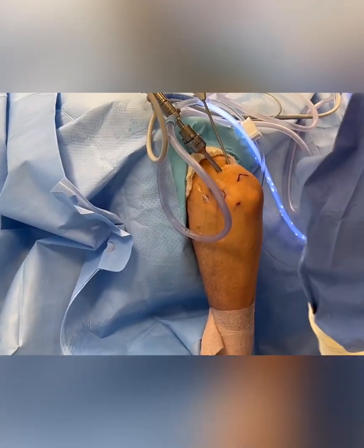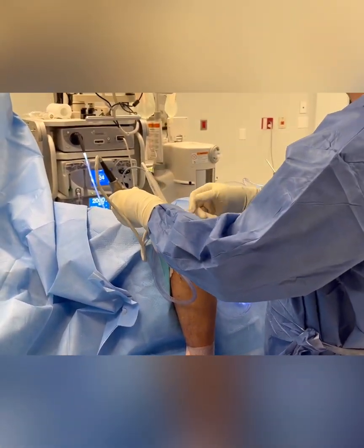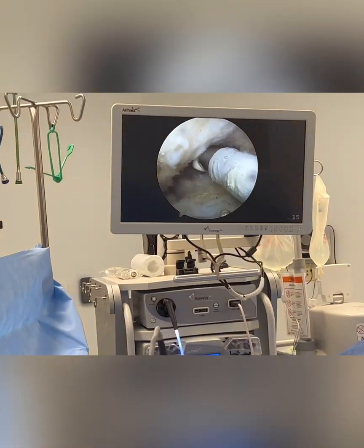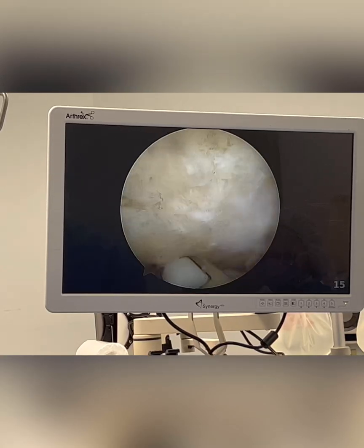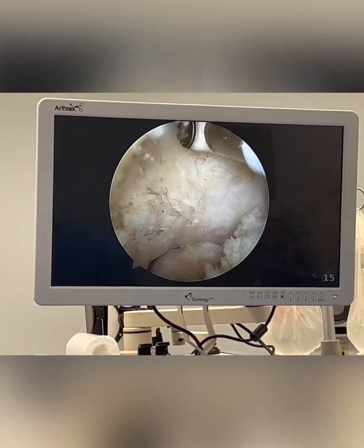This is the patient's elbow. It's dangling down, so the hand is dangling with gravity. My camera's inside. I'm looking at the back of the elbow. It's a little tricky place to be in, but that's where we are — the back of the elbow. And this is what we have from the anatomical standpoint. This is the distal humerus of the elbow. This is a fossa, a little opening. You see that little opening right there?